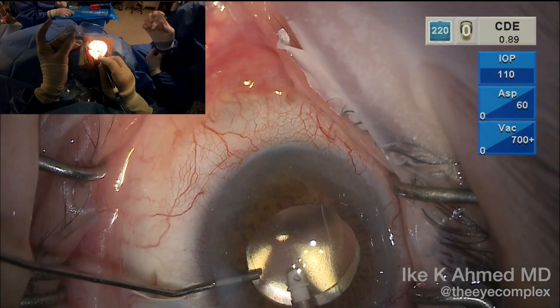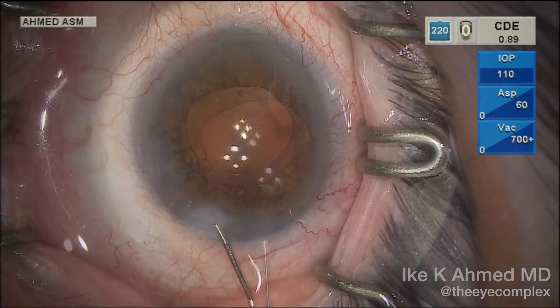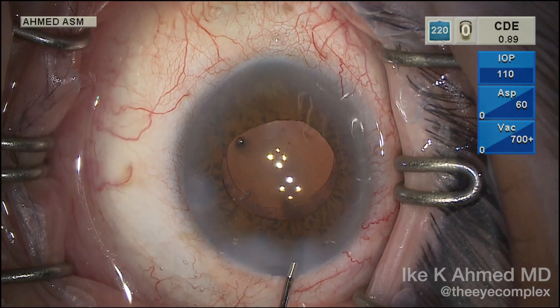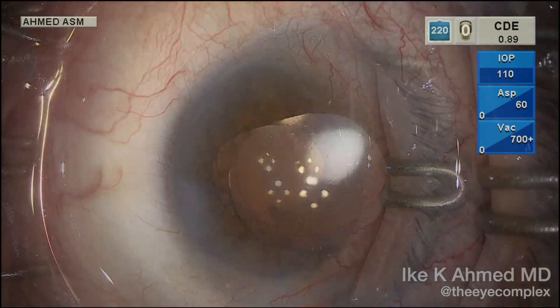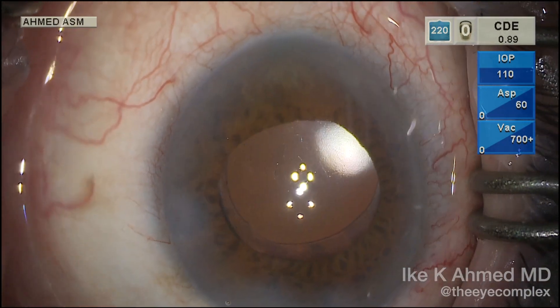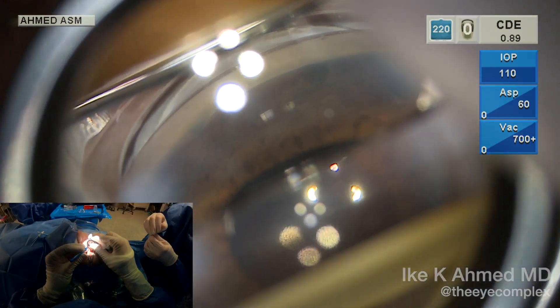At the end of the case, it's important to prevent blood reflux and hyphema to prevent pressure spikes. Before we pull out, we inject BSS into the anterior chamber, hydrate that wound to ensure it's watertight, preventing any hypotony occurring toward the end of the case, which will prevent blood reflux — pressurizing the eye to about 25 to 30 millimeters of mercury. This will resolve quite quickly, and we see at the end of the case there's no blood in the anterior chamber.